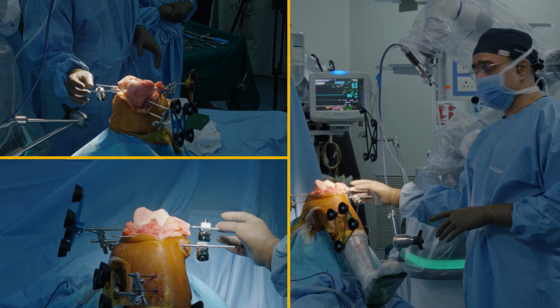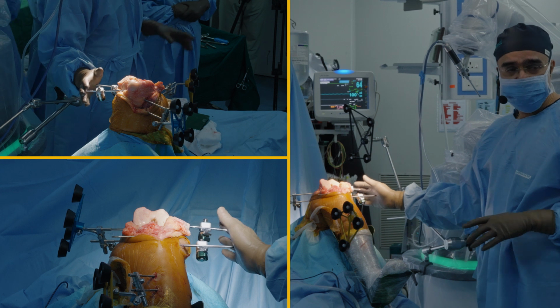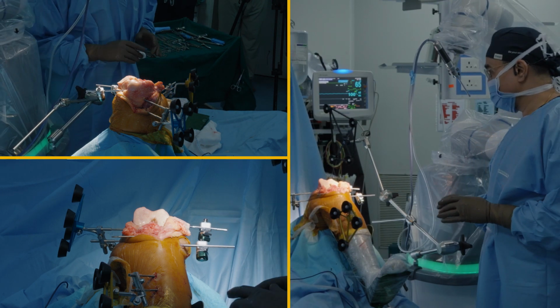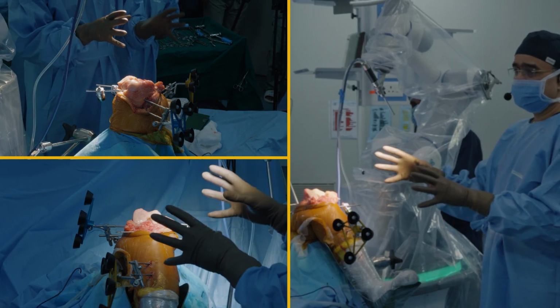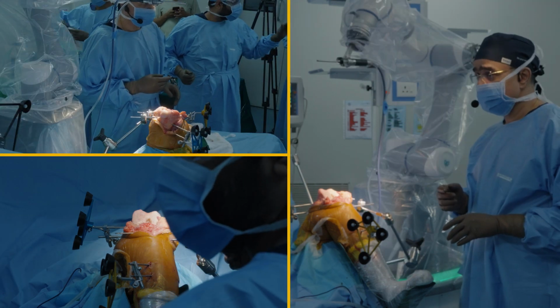We have attached these pins for the femur and tibia and these clamps. With this, the patient's knee joint, the patient's body, will be attached to the robot so that it should not move. So both those circle arrays should preferably be in the center of those circles. Start.